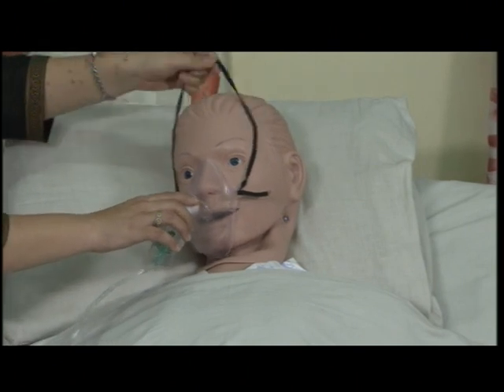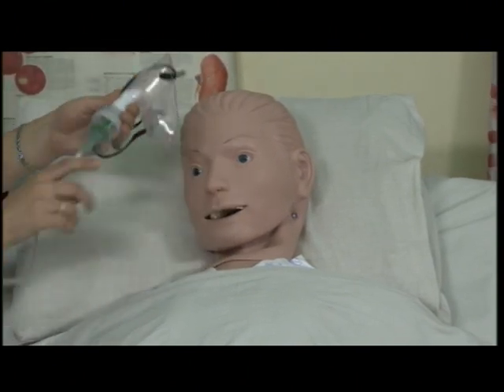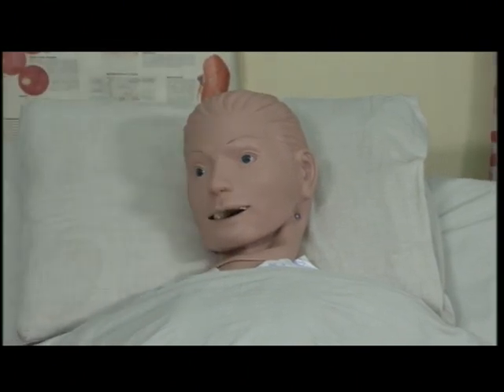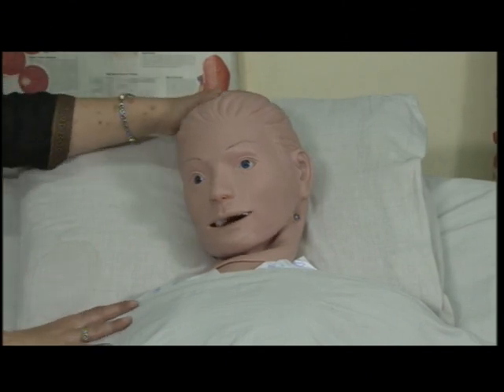Now I will remove the oxygen mask from the patient and make the patient comfortable.